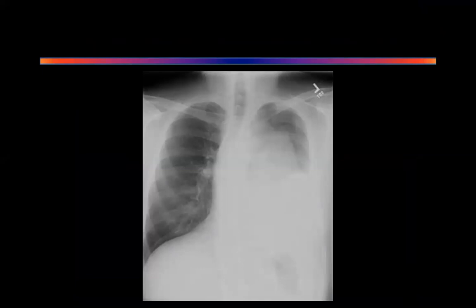Who's that? Somebody said chest X-ray PA view. Srinivas, take it. Sir, chest X-ray PA view. The left lower zone opacity. The mediastinal and the pleural borders are merged, and the diaphragm also is not seen. Okay, good. So most probably massive left-sided pleural effusion.